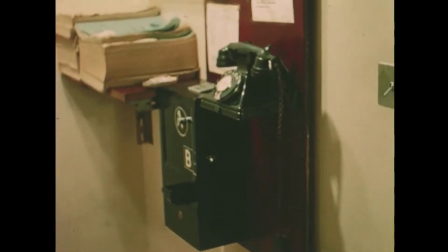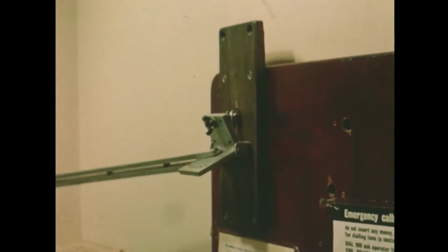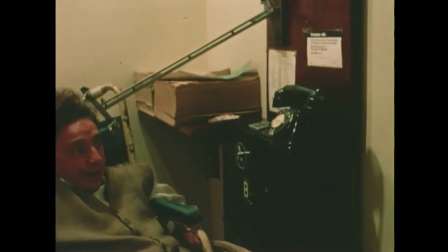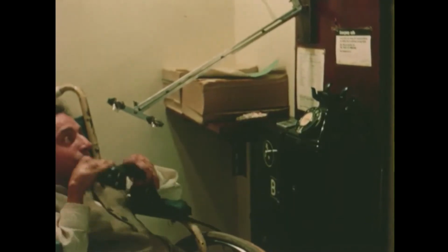Telephoning is difficult to do independently. A first step is a receiver holding arm. An extendable metal arm sticks out at right angles from a wall above an old-fashioned black telephone. It is then slightly unscrewed from the board, allowing it to drop slightly and to be swung left and right. If there were no holder, Nipper would have to get someone to hold the receiver for him, limiting both the length of call and what he could say on it.